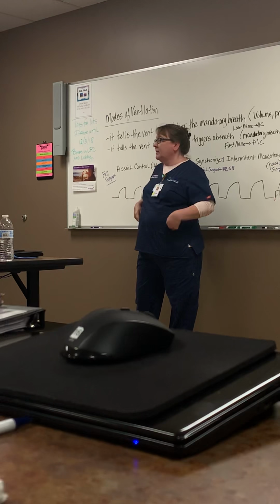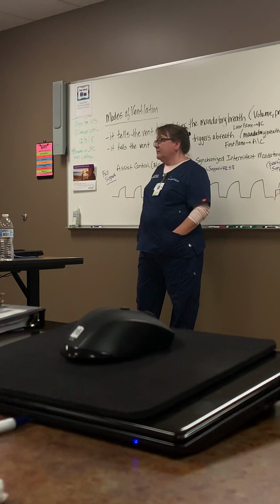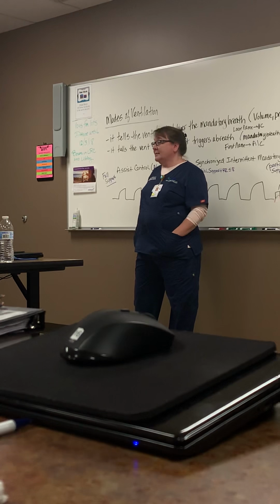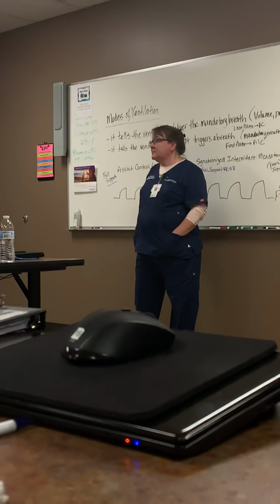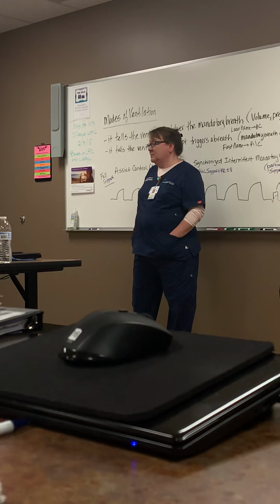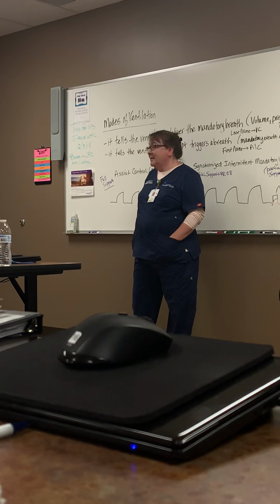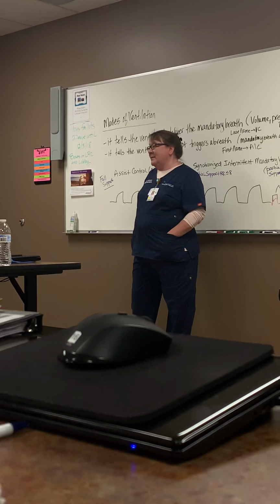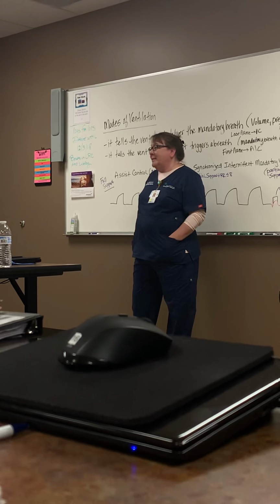Yes. So you're saying that people are going AC to wean off the vent without going to SIMV? Yes. So is that why they're doing AC, like we have these right now, they're doing AC and then they're doing a bunch of SBTs throughout the day? And is that how they get them off? Yeah, we don't normally recommend SBTs all throughout the day. Normally it's done once in the morning.